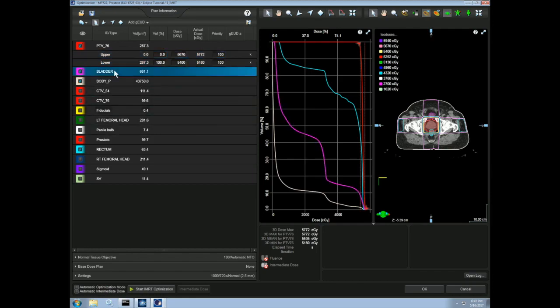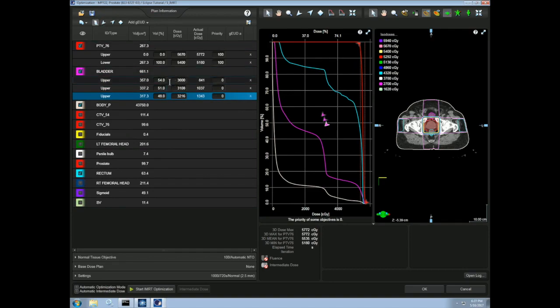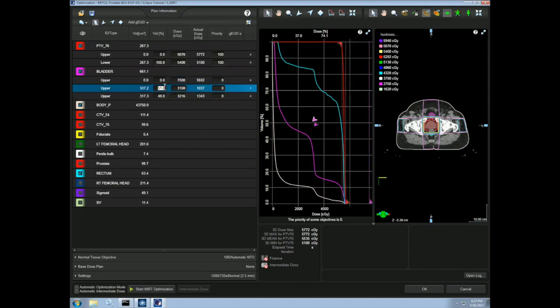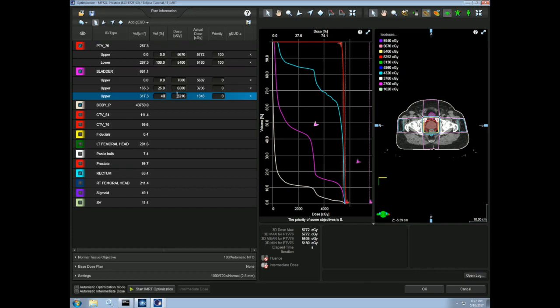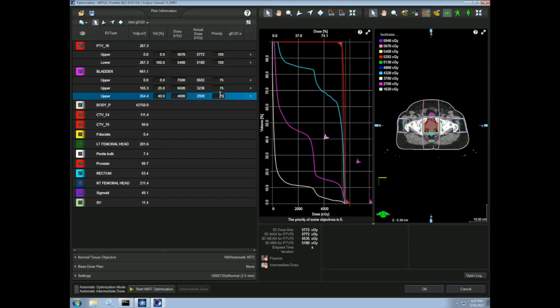So now let's add our three constraints to the bladder. These will be upper constraints. We'll want 0% of the bladder to get any more than 75 gray. Our next constraint, we'll want less than 25% of the bladder to get more than 65 gray. The last constraint will be no more than 40% of the bladder can get 40 gray. We'll use a priority of 75 for now on all of these constraints. There often may be an inherent trade-off between limiting dose to critical structures and achieving ideal coverage of the target. These priorities can be weighted to achieve the balance that you desire between them.